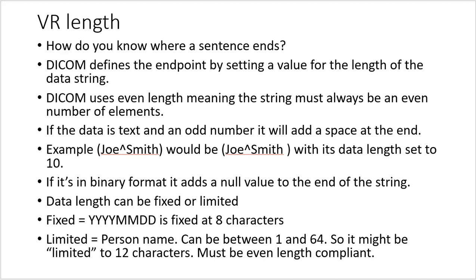How do you know where a sentence ends? Because it's got a question mark right there, right? We know where a sentence ends in a written statement because we always end it with punctuation. So DICOM defines the endpoint by setting a value for the length of the data strings. That's why you have these character limits, so that it knows where that chunk of data ends.